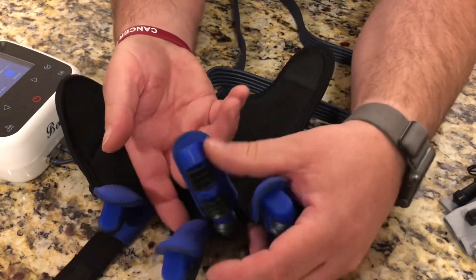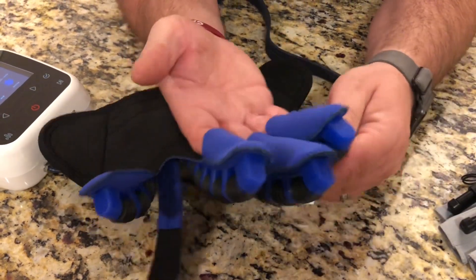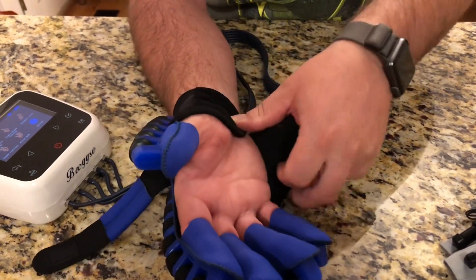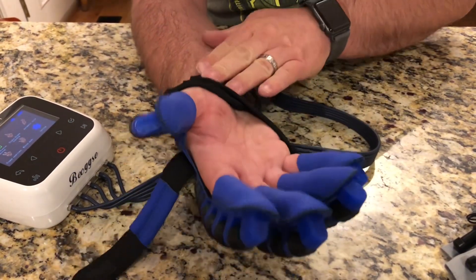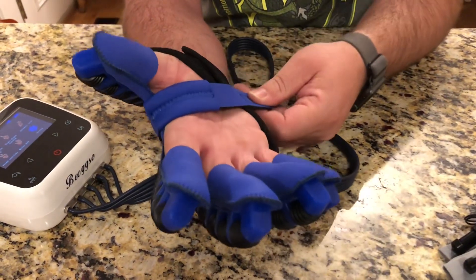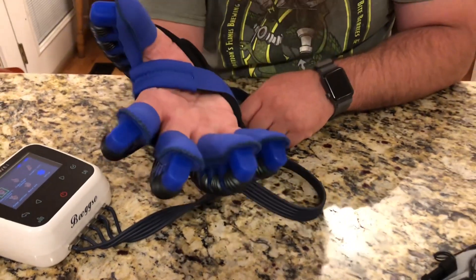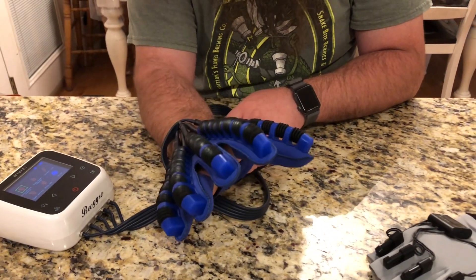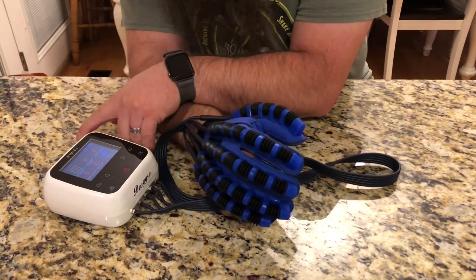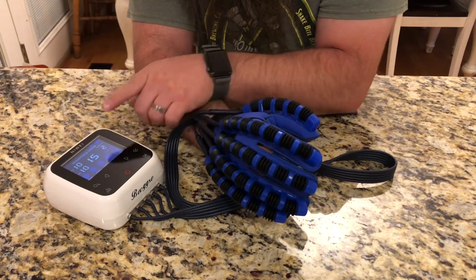To put on the glove, you're gonna take and put each finger inside each one of these little pouches, including the thumb. Then you pull the strap around and grab this strap here and wrap it across the top of your palm. Now I've got the glove on and we are ready to start using it.